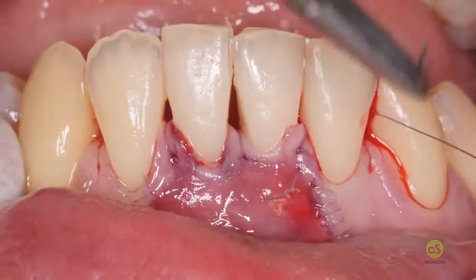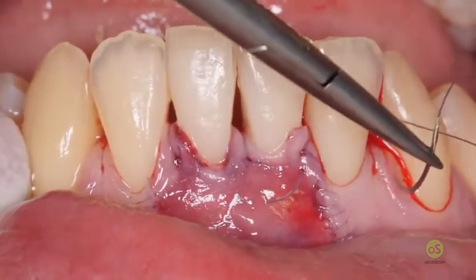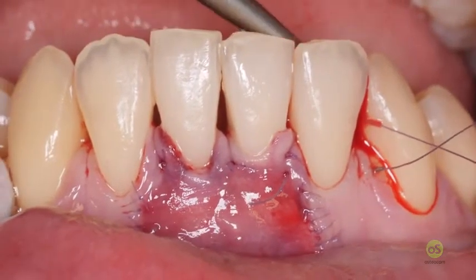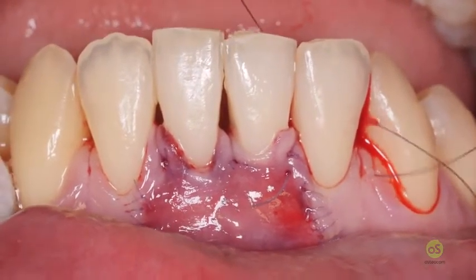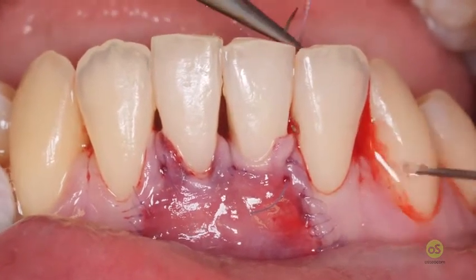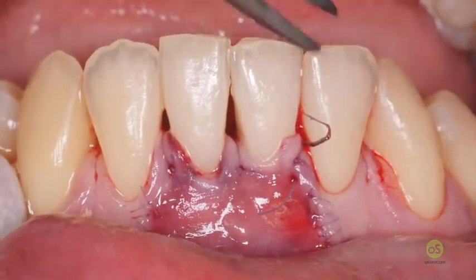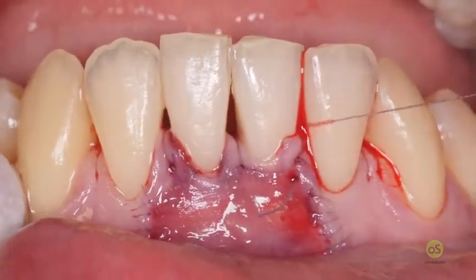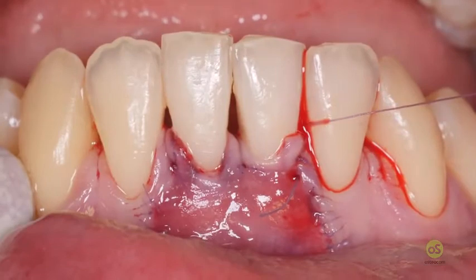This is the sling, which is the definitive one. I place the anchorage to the different area, so I recognize the first with respect to the second one. And now, before closing this, I will remove the surgical knot.